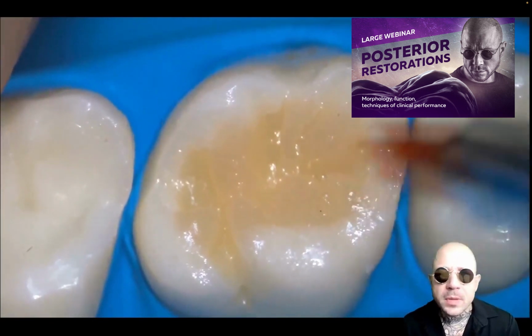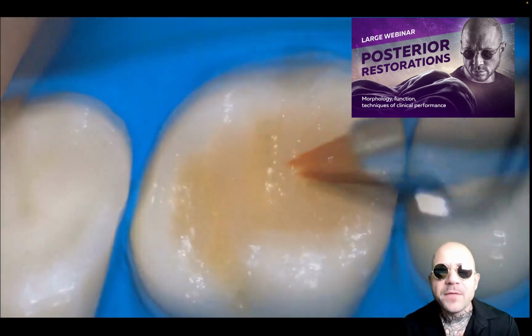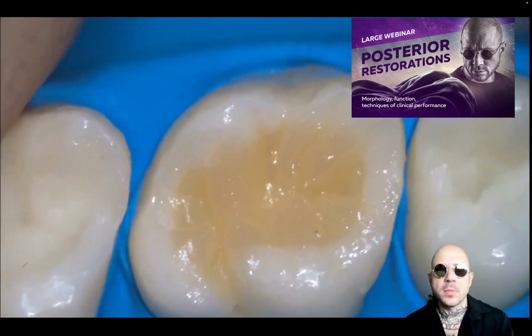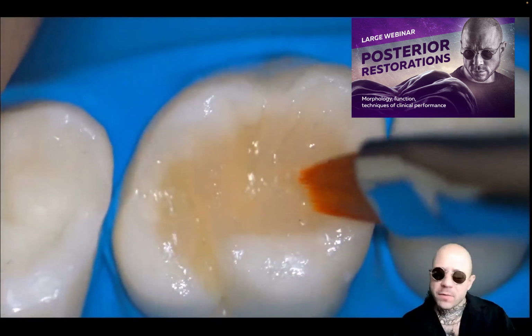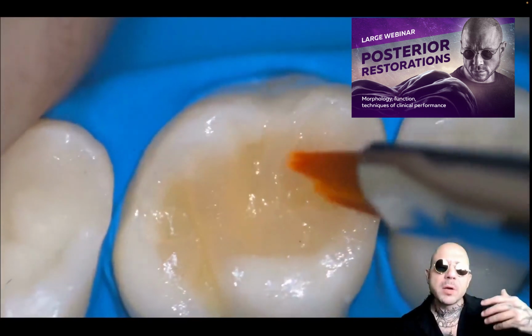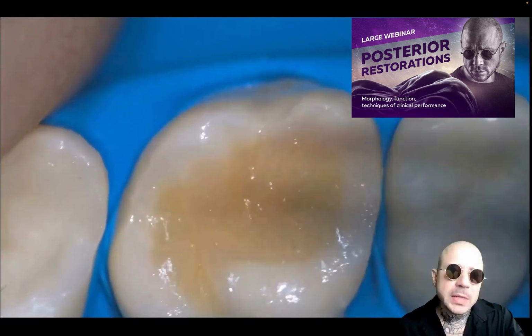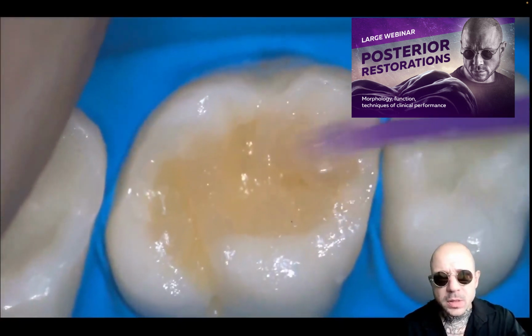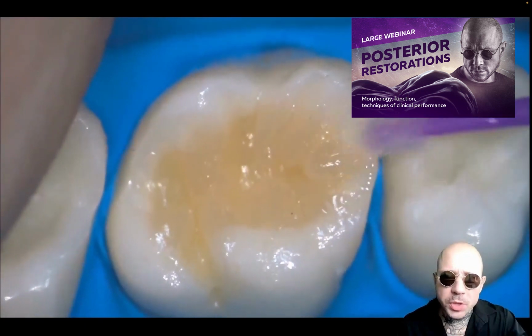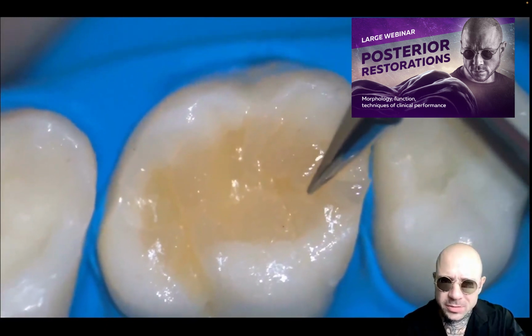And when the occlusal surface is filled with a bigger number of elements, that complicated area will be solved and will become more clear by itself. It quite frequently happens like that in my own practice as well. So one by one, the ridges are placed in their position.